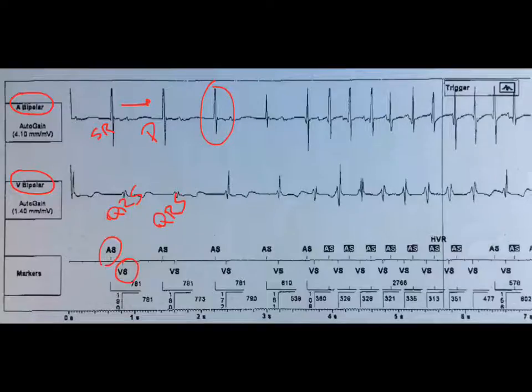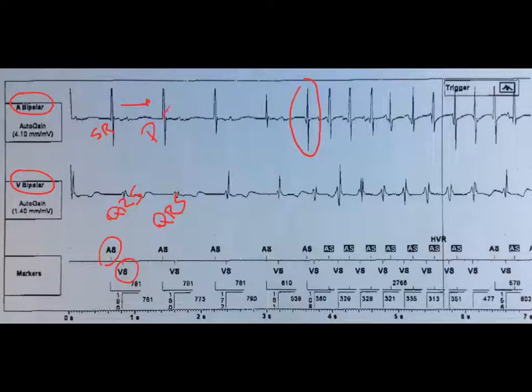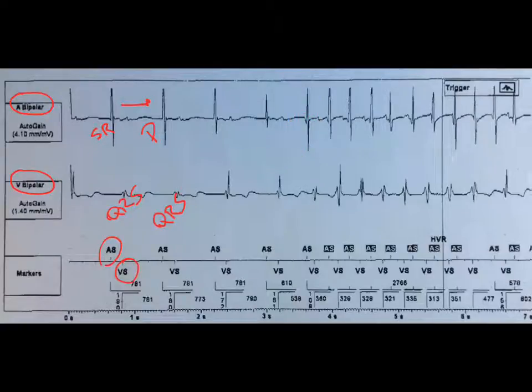How about this P wave? The question is, is it similar or different to the previous ones? Number one — is it similar? Yes. The other question is, does it come at a different interval? From here to here we have one interval, that is the same as that. And this one — does it come sooner? Sure. So it's probably a PAC. Is this a PAC or a sinus? It's probably a PAC.